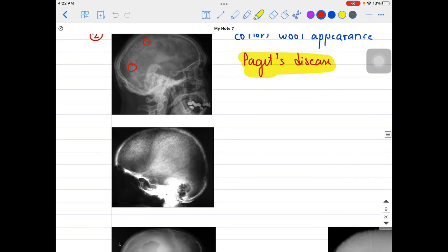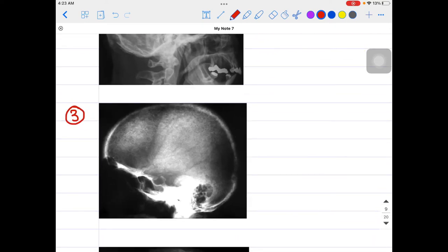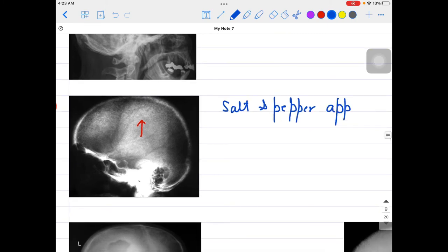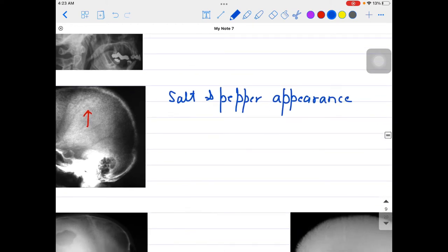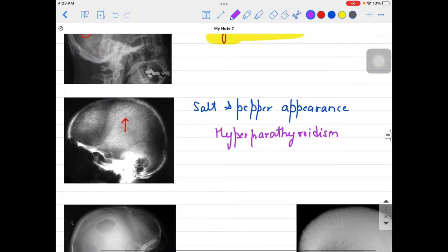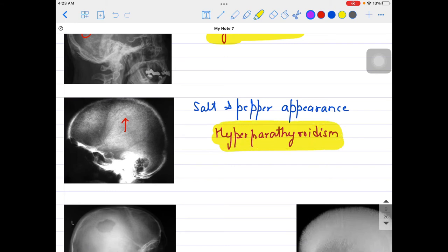The third skull on screen has a special appearance compared to salt and pepper — as if someone has sprinkled salt or pepper on the skull. This is the salt and pepper appearance, and it is very commonly seen in hyperparathyroidism. Hyperparathyroidism is covered in pathology, orthopedics, and medicine, so because it spans several subjects, questions from this topic come up very frequently.